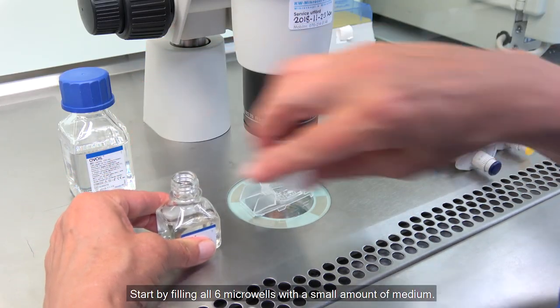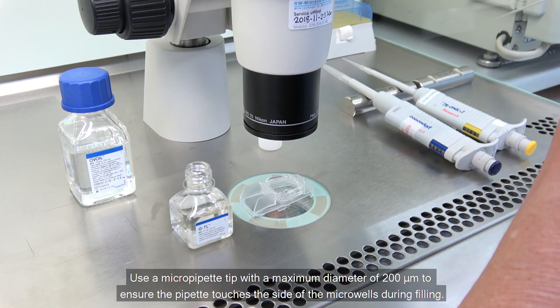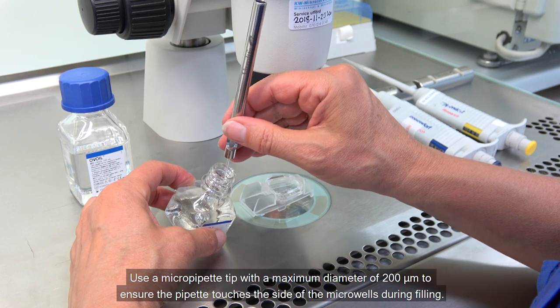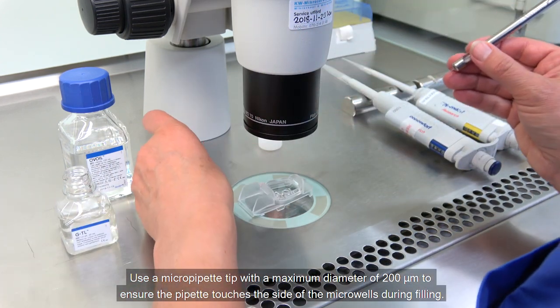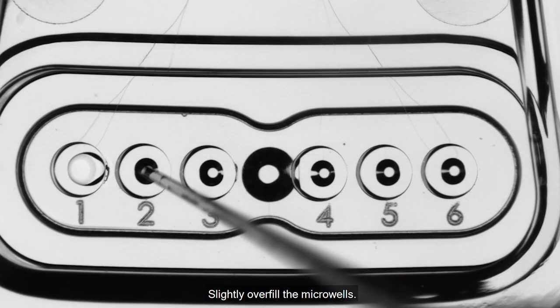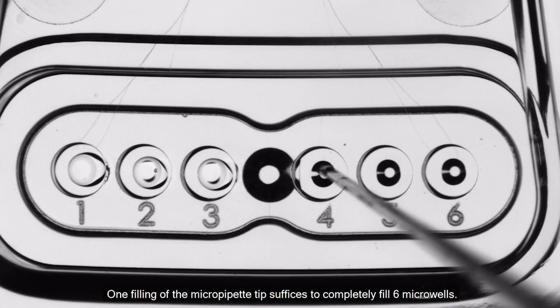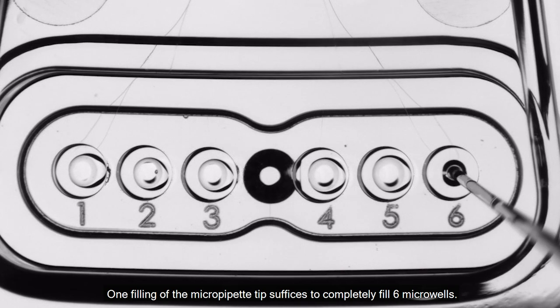Start by filling all six micro wells with a small amount of medium. Use a micro pipette tip with a maximum diameter of 200 micrometers to ensure the pipette touches the side of the micro wells during filling. Slightly overfill the micro wells. One filling of the micro pipette tip suffices to completely fill all six micro wells.